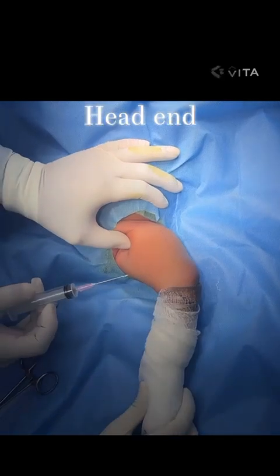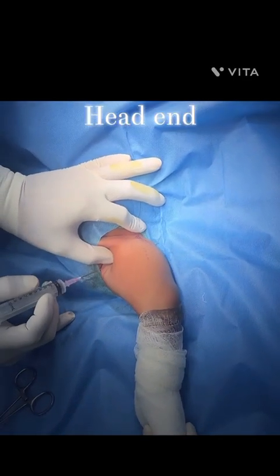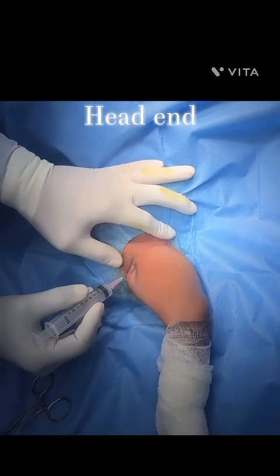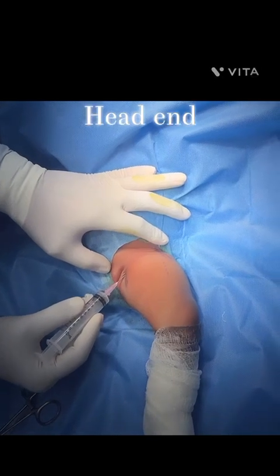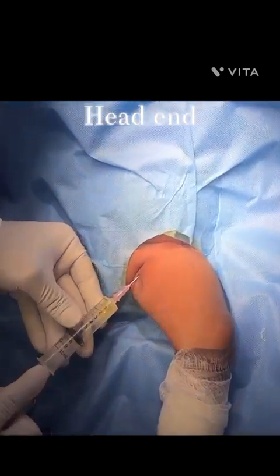To palpate the adductor tendon, go below the adductor tendon, directed towards ASIS and 45 degrees to the floor. Once we hit the bone, that is the neck of the femur and inside the hip capsule, we aspirate.